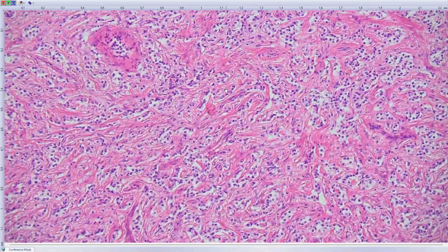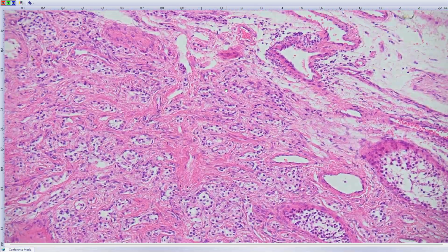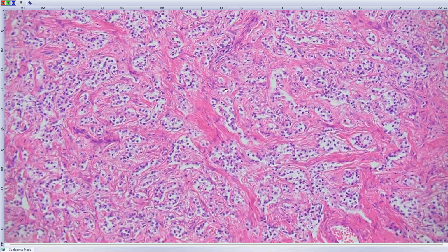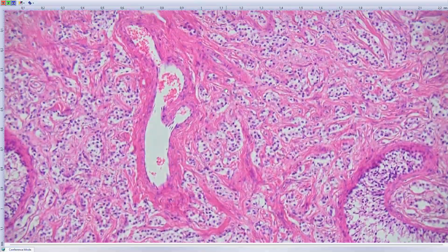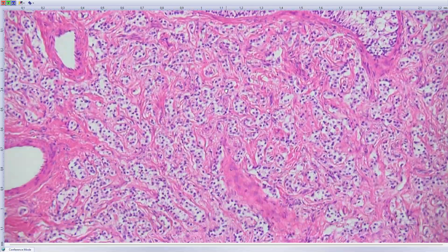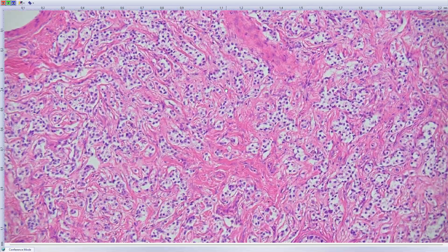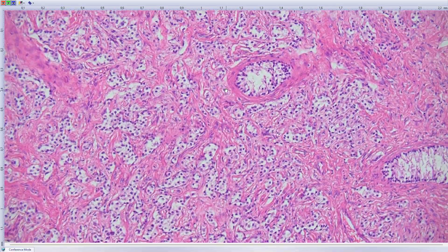But as for cytology, these tumors are the same as we saw in the pancreas and ovary, and if we do immunohistochemistry, the immunoprofile will be largely overlapping with pancreatic and ovarian tumors, as well as genetic features. So there is beta-catenin mutation, or CTNNB1 mutation, in the testis as well.